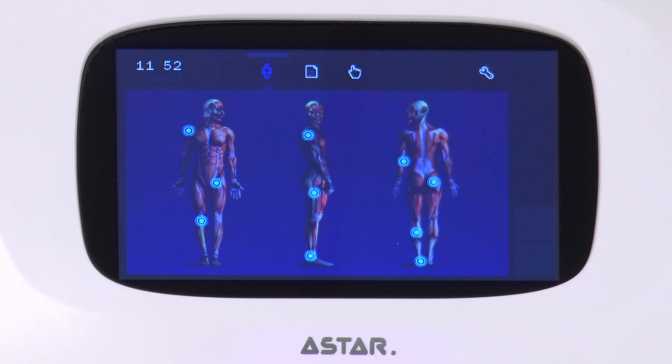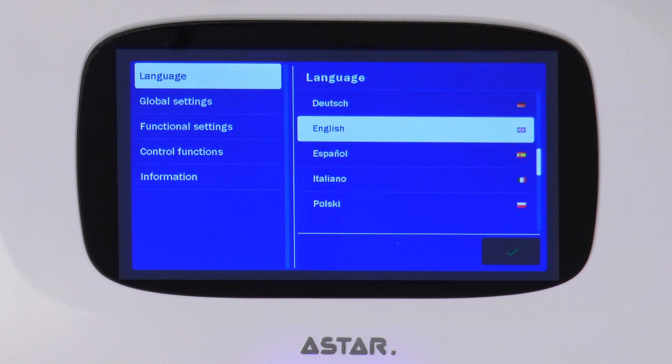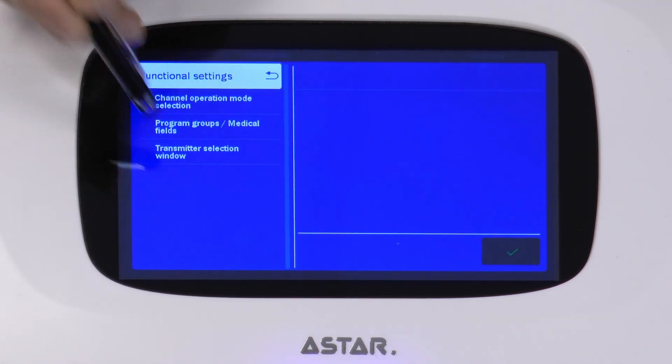To activate it, go to Setup mode, Functional settings, Transmitter selection window. Mark the selection field and press OK.